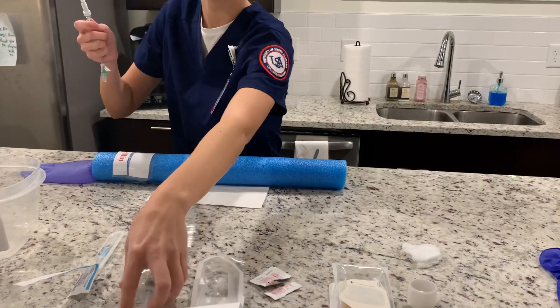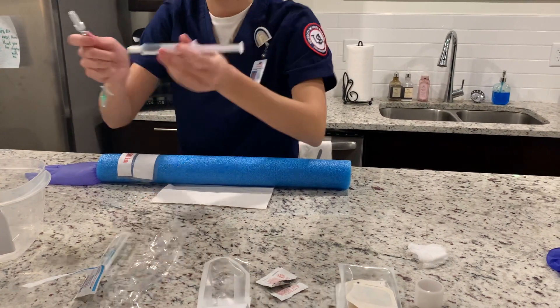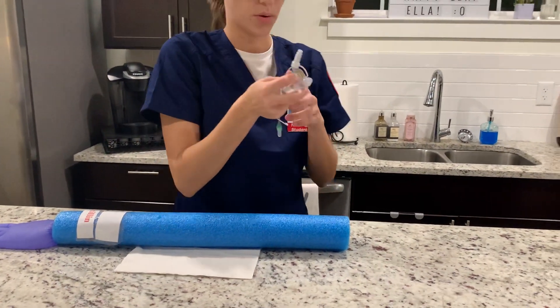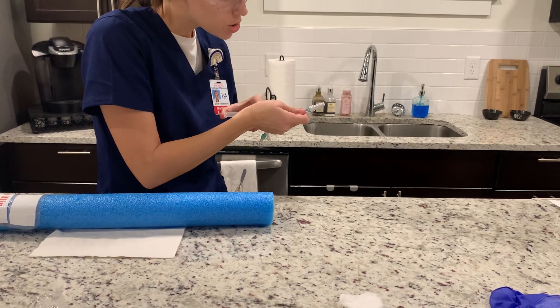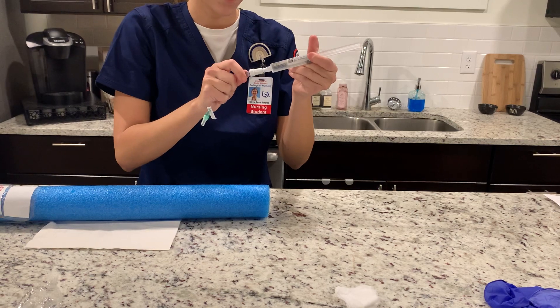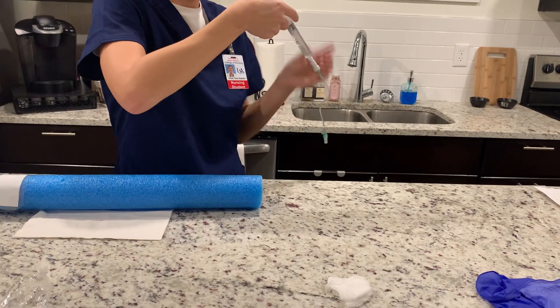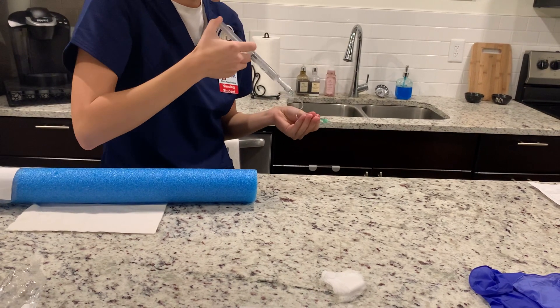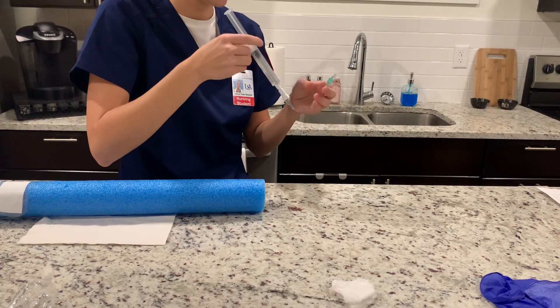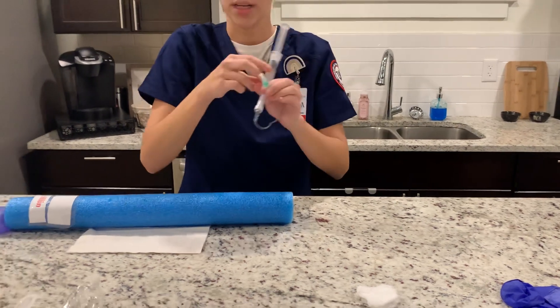Now I'm going to take my saline, remove the cap, and prime it, making sure it's primed. I'm going to connect it and prime it one more time. Put the cap on. Now I'm going to loosen the cap just so it's easier to remove later.